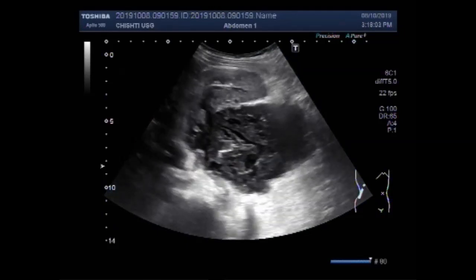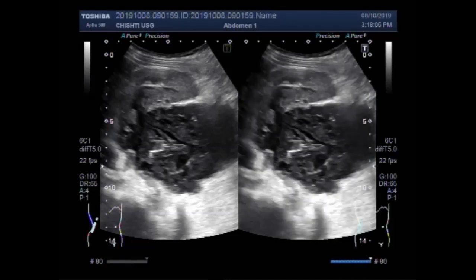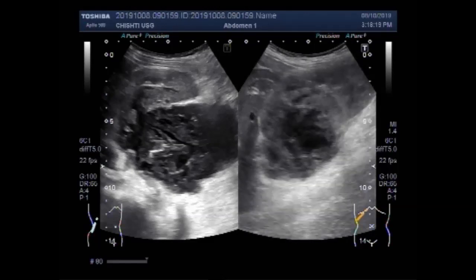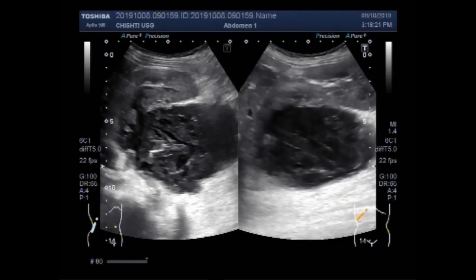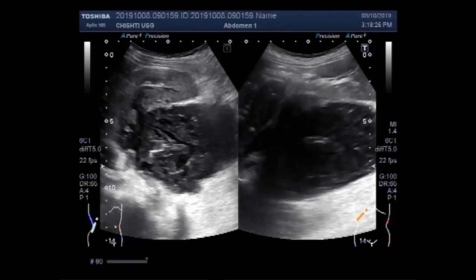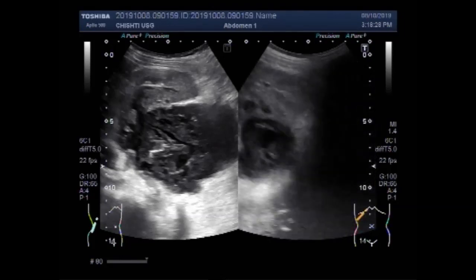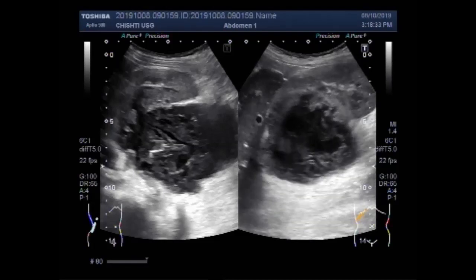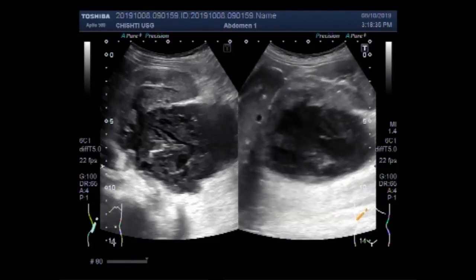Again, you can see this mass and the right kidney. Here is the right kidney — renal cystic mass. Now the patient is lying supine, and you can see this mass attached to the upper pole of the kidney.